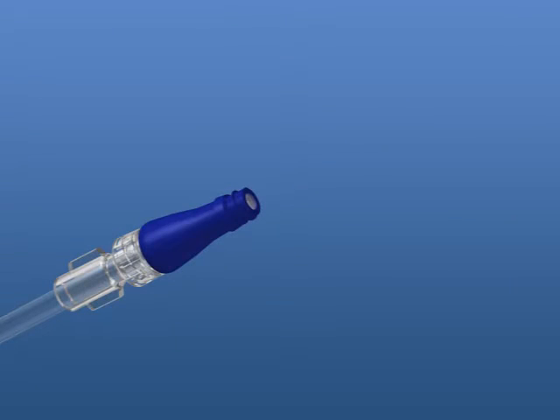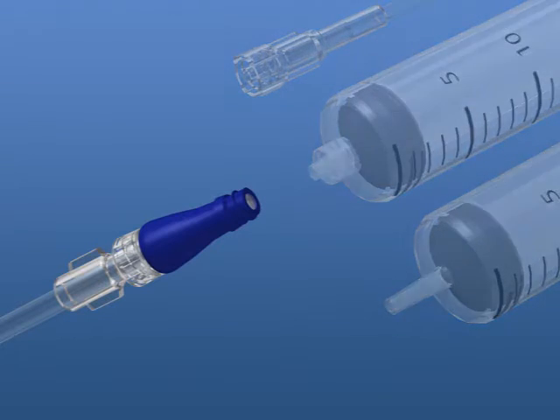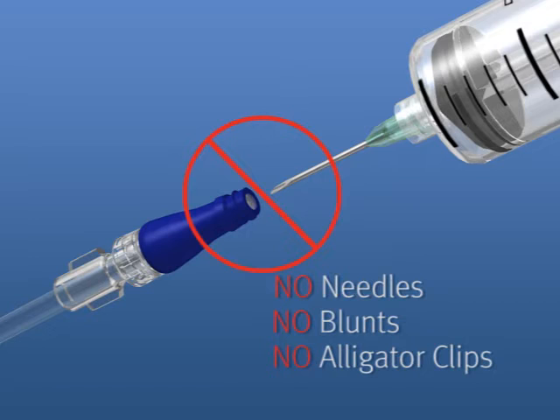The Microclave accepts both spin lure and slip lure connections. Do not use needles, blunts, or alligator clips to access the Microclave.